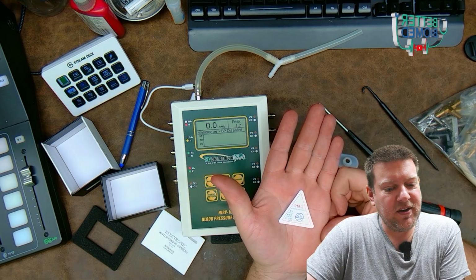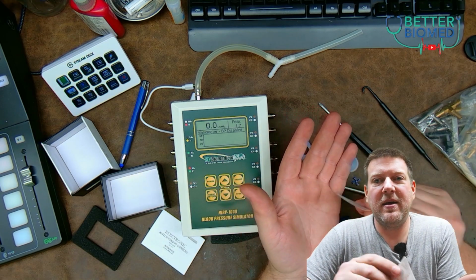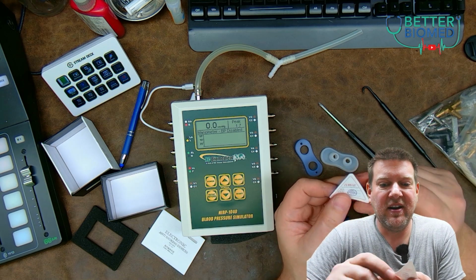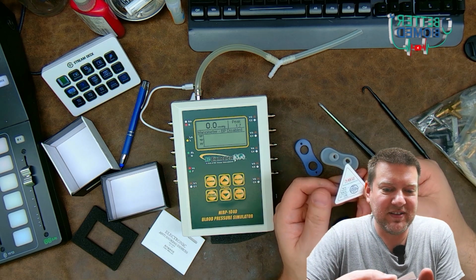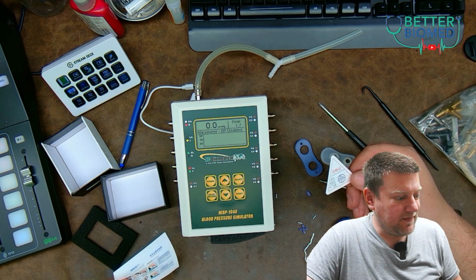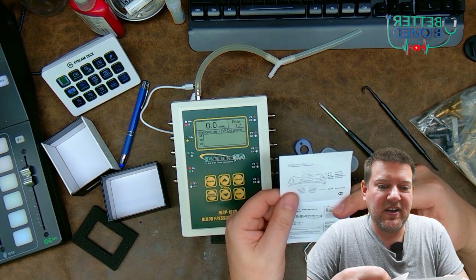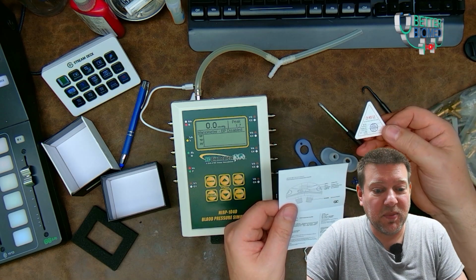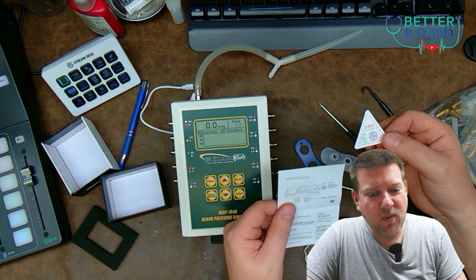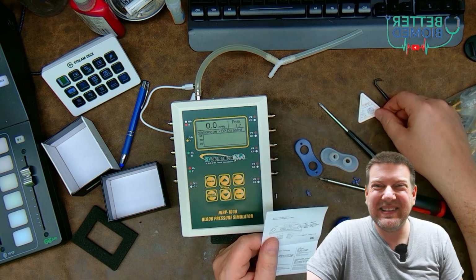Take a look right there. QC pass, inspector number 11. How much do you want to bet they mass produce these guys right here and they just throw them in every single package? There's no way that this was quality controlled. Yeah, this is what it is. Gosh, they actually give you an instruction book, exhaust port. What? Intake port, exhaust port. What?